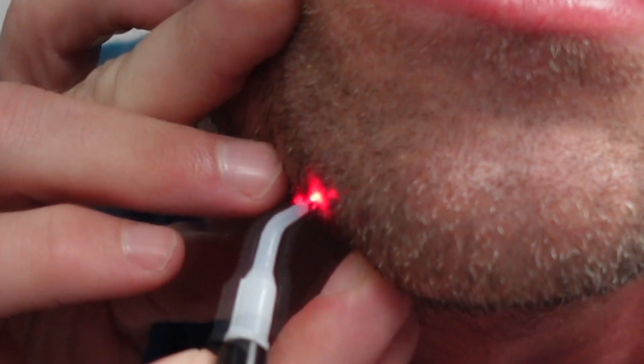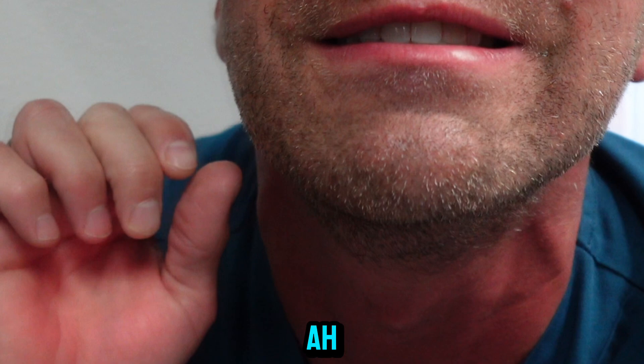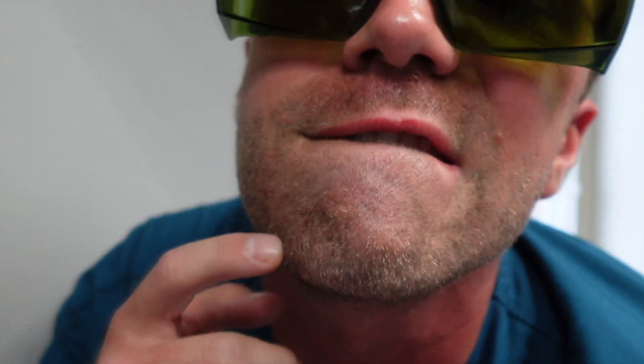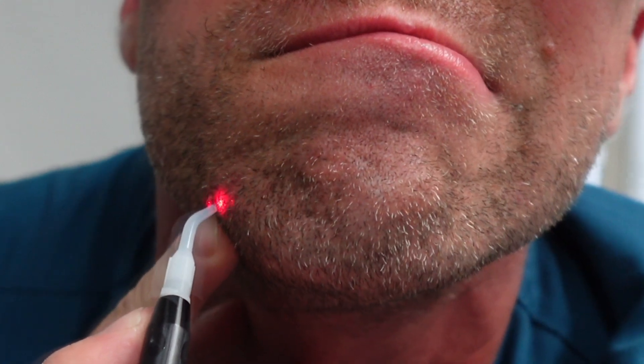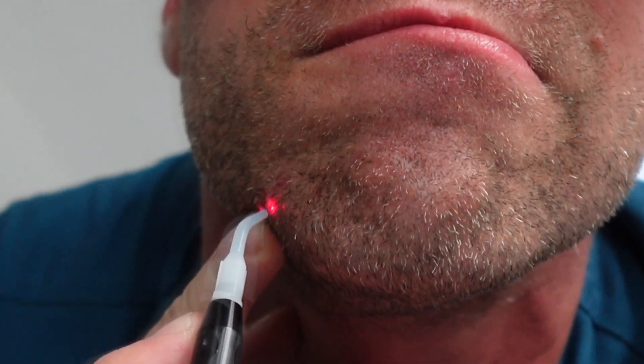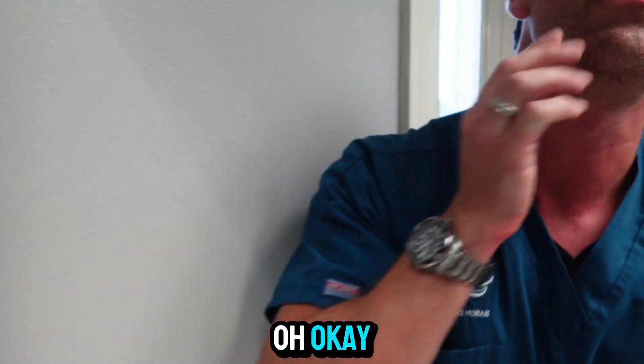Here we go — ah! Did I get it? I better get just a little more. Okay, oof!